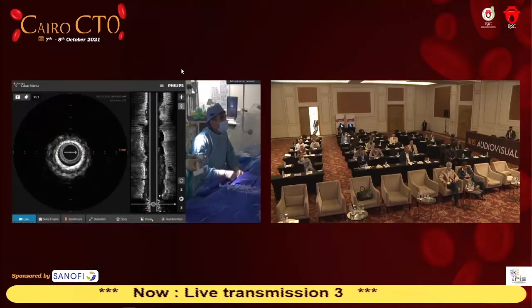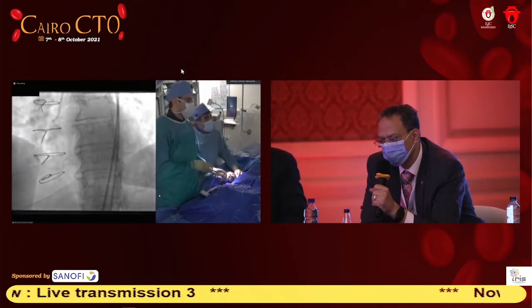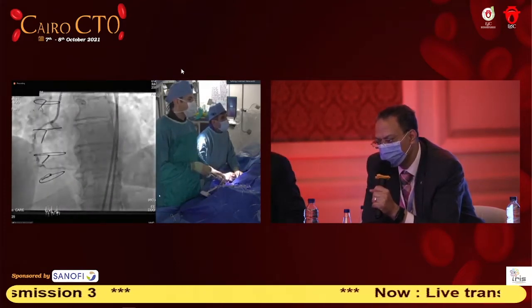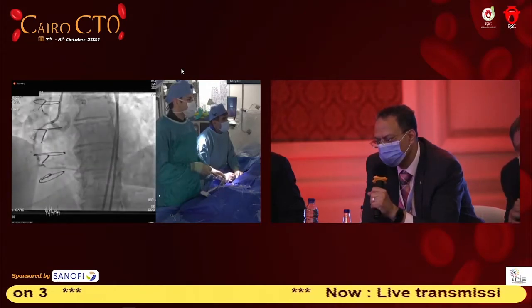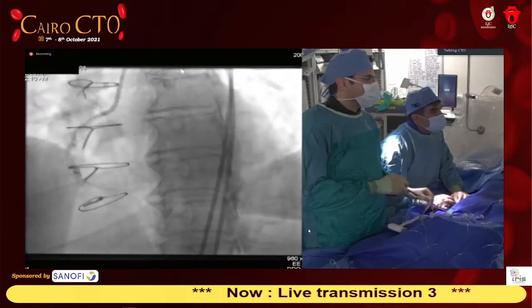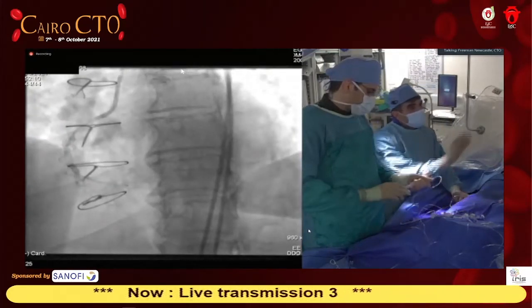Okay, so you can go higher if you want. Yeah, I could go higher, just so I don't cause any perforation or anything. Go back one for me. Are you back? Can you see the angiogram now, yeah? Okay, so we're going to start from there. Can you put a little test there for me? Can you go a little bit distal? Okay, just go up there. This is okay. Yeah, I mean, we covered that area there.